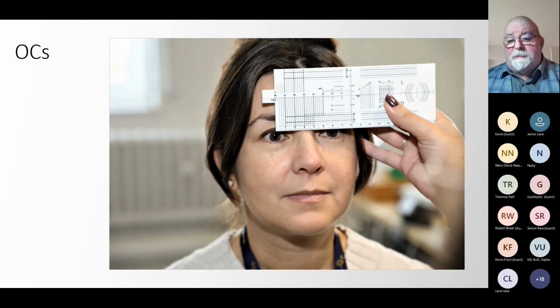We've come from the opposite side here to demonstrate that we're now remeasuring this from the inner to outer edges of the pupil. And again, from this angle, we can see a little bit more clearly that Kat is just resting the fingers gently at the side of the head, so that the patient can't shake and the ruler can't shake, so that we've got a stable reading there.